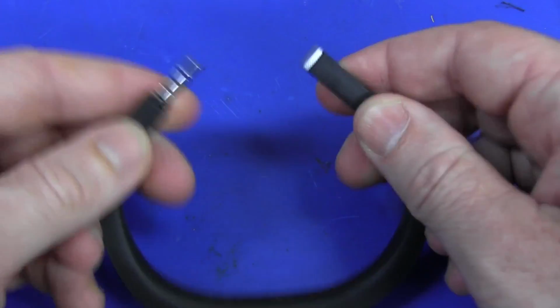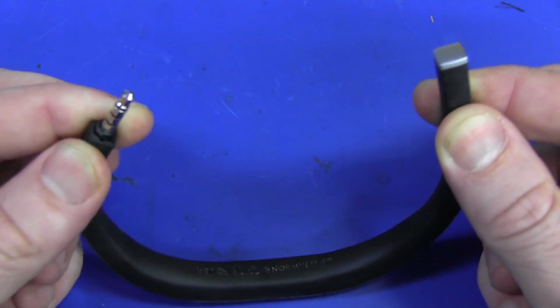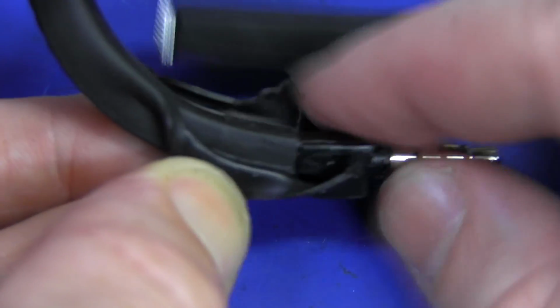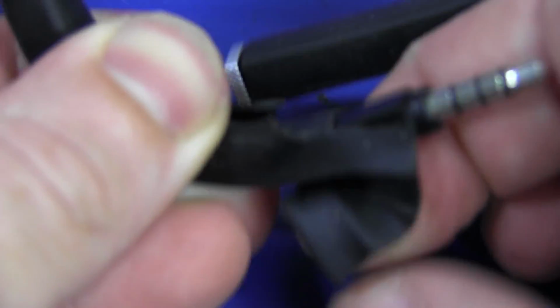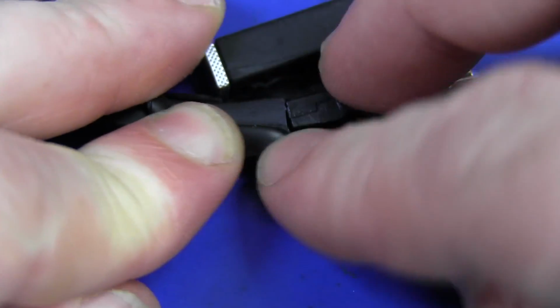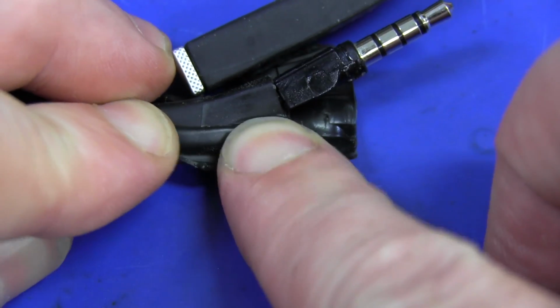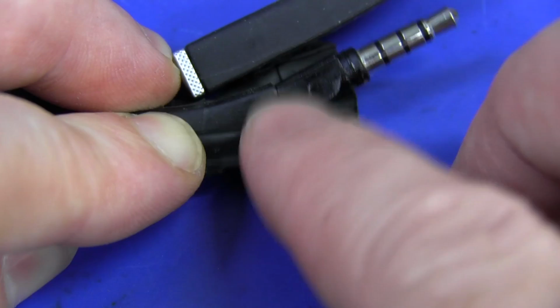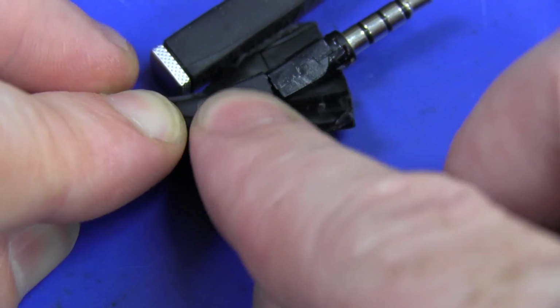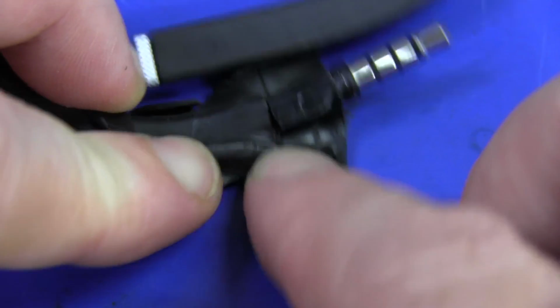It's all nice and flexible, and it's got rubber. I don't think I'm going to wait for Teardown Tuesday. I think I'll just slice it open with a knife and see what's inside. And I'm trying to slice this thing open here, and it looks like there's this outer rubber which kind of peels off like that, but then it's sort of integrated into the inner rubber square core. So there's that outer one, and that's sort of all completely integrated into that bit. So yeah, it's not as easy as I thought. I thought I'd just be able to slice this thing open, but it requires a bit more work.